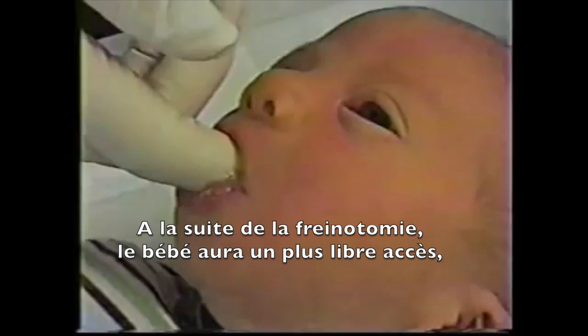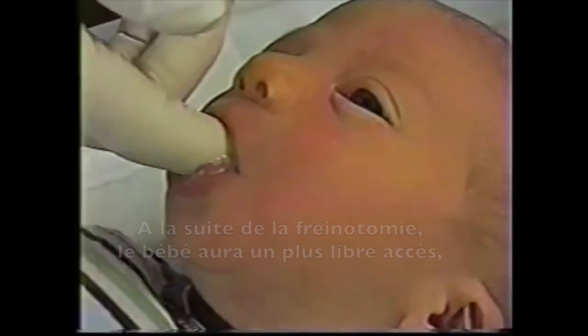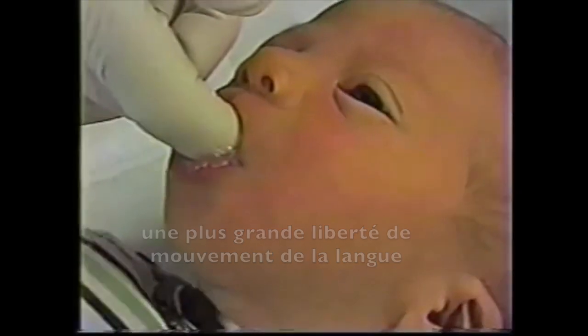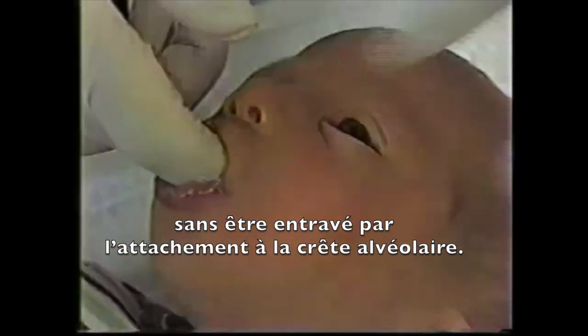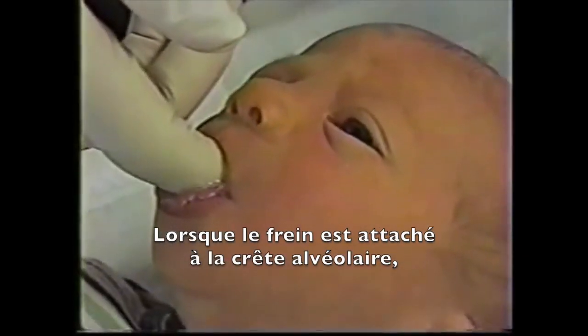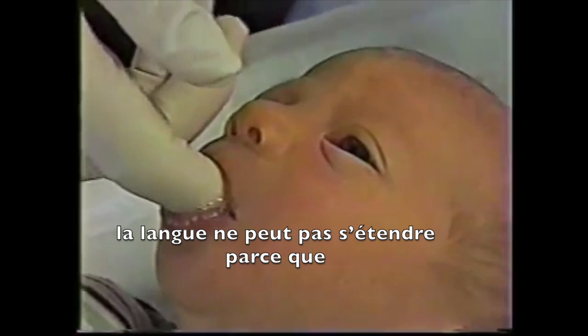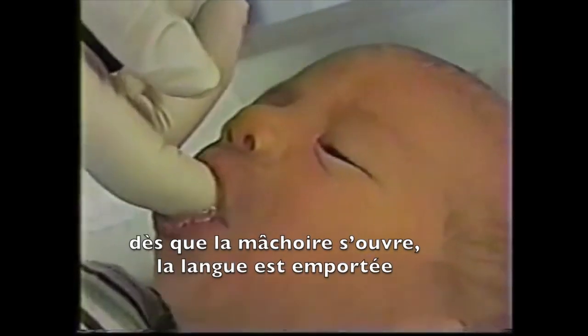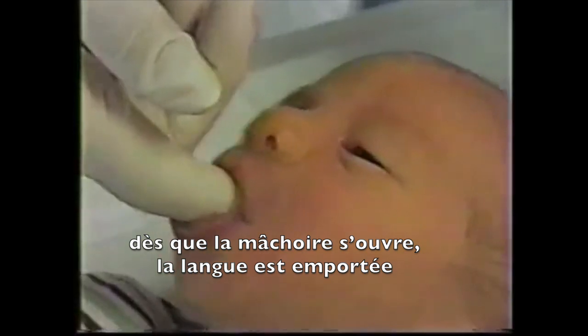After that, the baby has free access and freedom of movement of the tongue without impeding the movement by its attachment to the gum. When the frenulum is attached to the gum, the tongue cannot protrude, because when the jaw lowers, the tongue is pulled down and they can't suck properly.